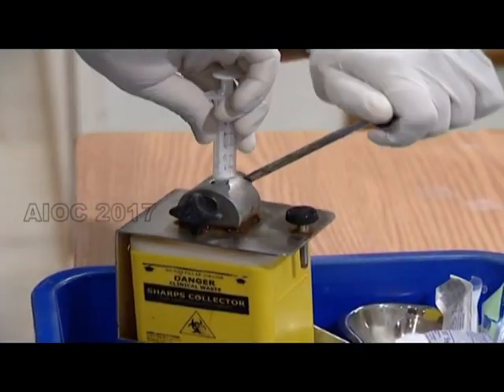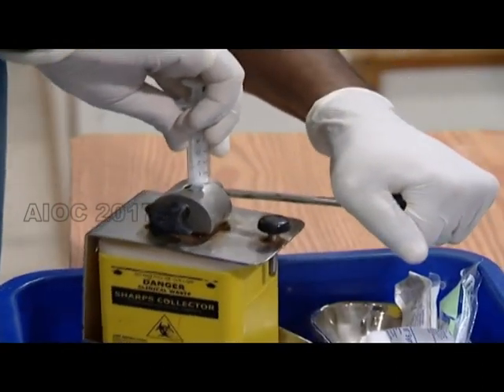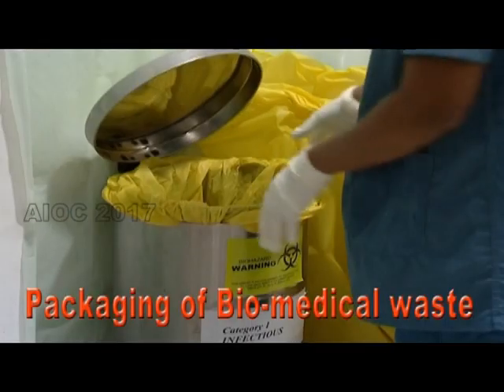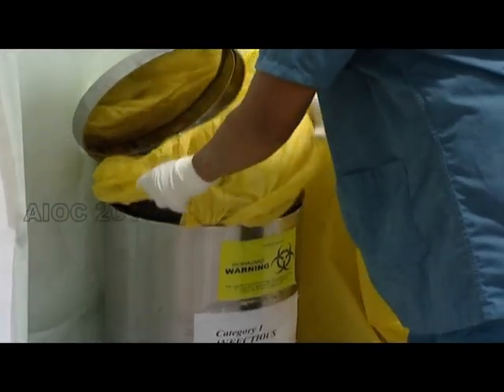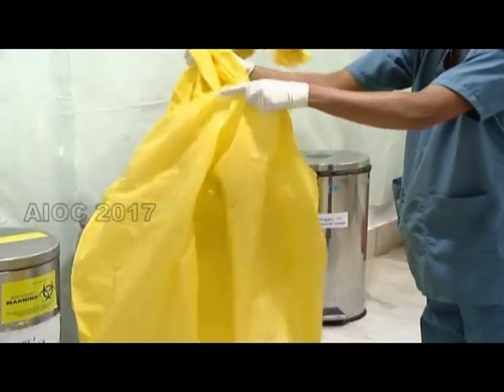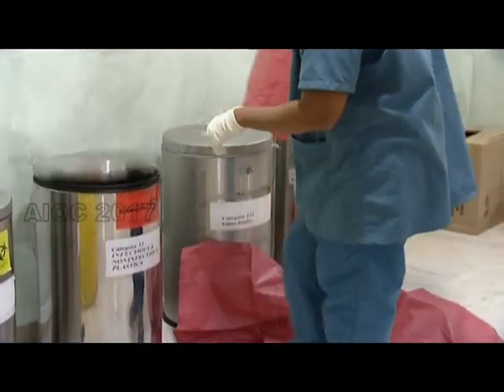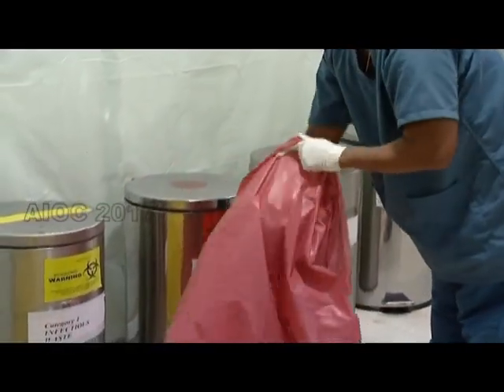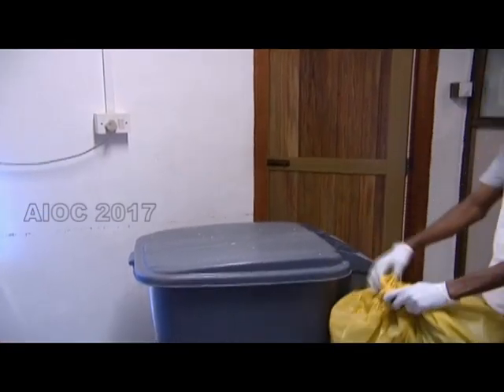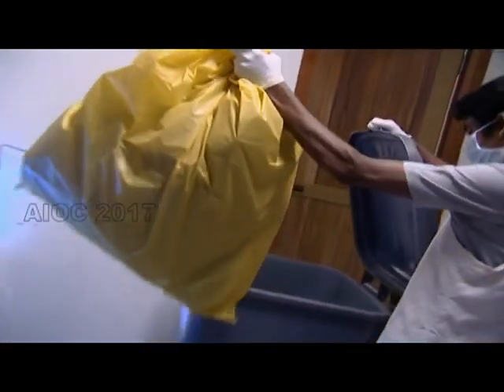To prevent reuse of syringes and needles, they have to be cut at the hub at the source itself. The segregated waste is double-packed before being transported for treatment. All of this is done while wearing protective gear, and the double-packed waste bags are transported in closed containers.